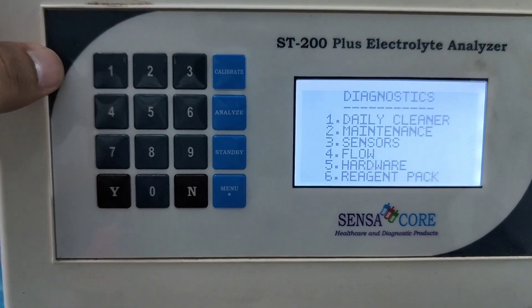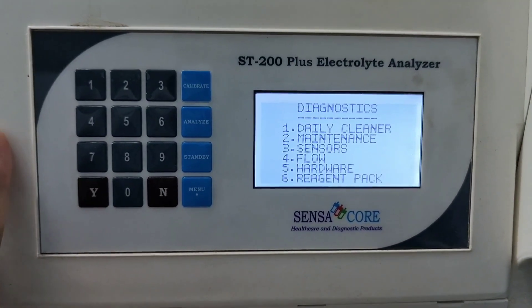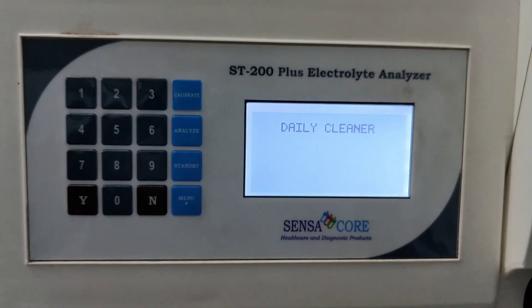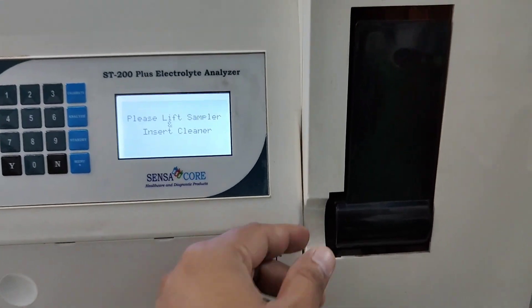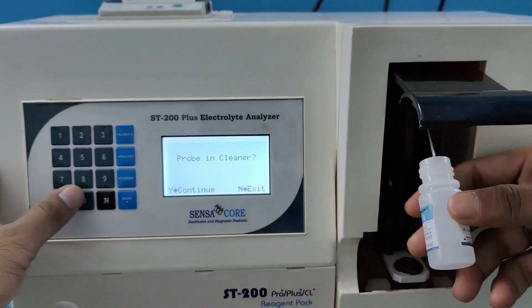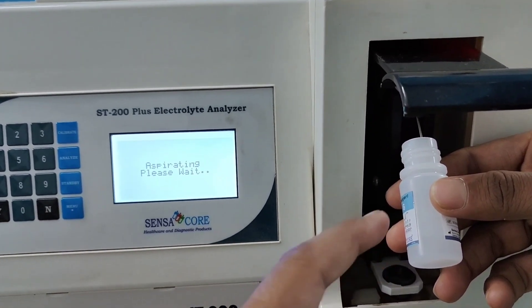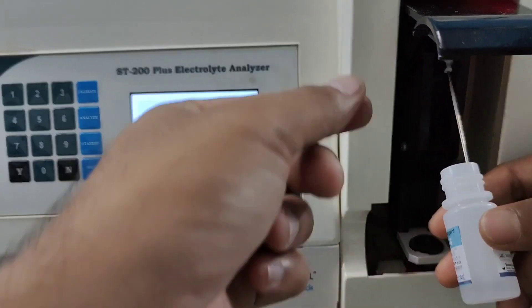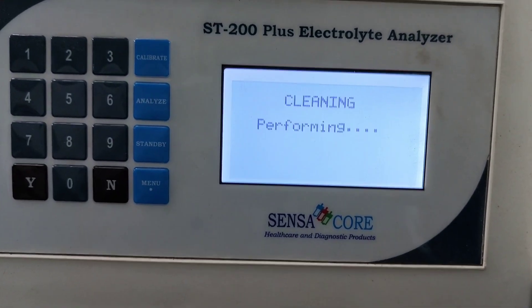Number 1 — diagnostics. Number 1 — daily cleaner. To maintain the proper functioning of this machine, you have to run a daily cleaner regularly. It's showing: please lift the sampler and insert cleaner. This is the sample probe. I am going to insert the daily cleaner. Make sure that the probe is in the fluid. Please remove the cleaner and close the sampler. Cleaning is performing.